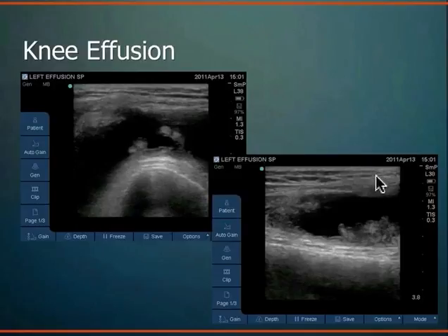This is that suprapatellar pouch of the joint space. So the knee joint space extends pretty far above the knee in that suprapatellar pouch. And when you have a joint effusion, that area can be extended or distended. And this is the fluid collection in there. So all fluid with some joint debris floating around. This is just a chronic, classic osteoarthritis presentation, seen quite well.